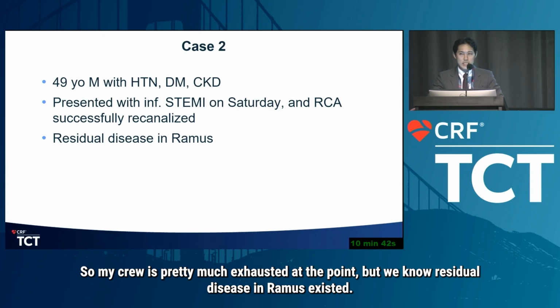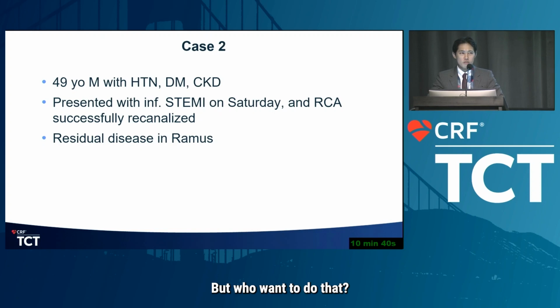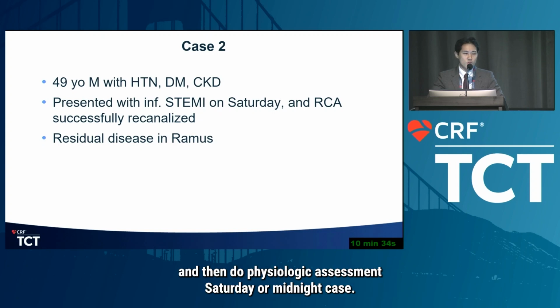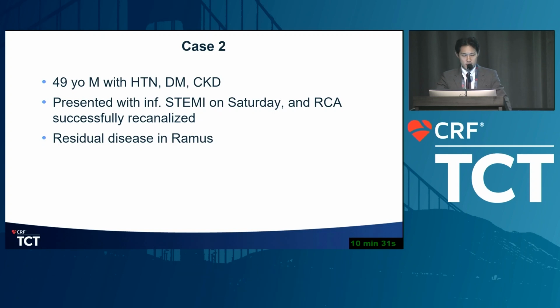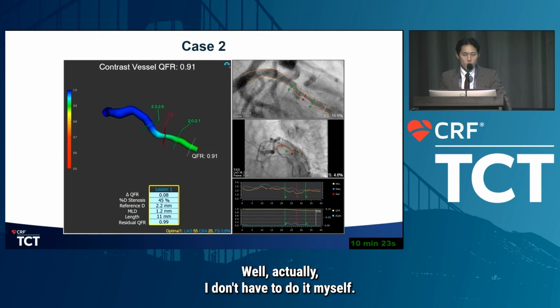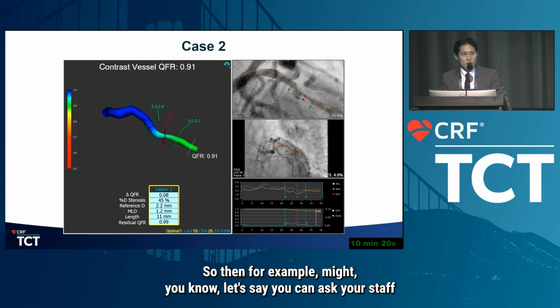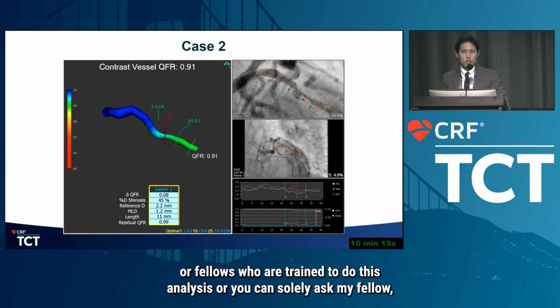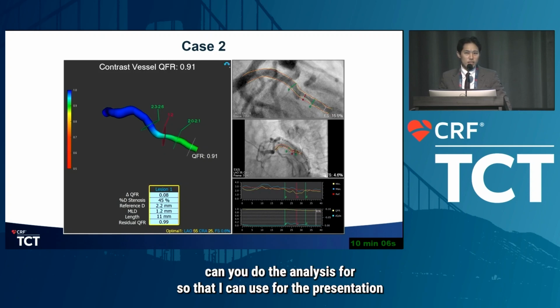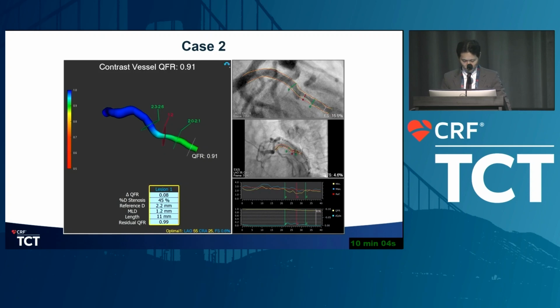But we knew residual disease in the ramus existed. Who wants to put the guide in the left coronary artery after the STEMI treatment and then do physiologic assessment on a Saturday or midnight case? So what we have done is you can do the QFR analysis retrospectively, let's say Monday daytime. Actually, I don't have to do it myself. You can ask your staff or fellows who are trained to do this analysis, or you can suddenly ask my fellow, hey, I have a presentation at TCT next week, can you do the analysis so that I can use it for the presentation?